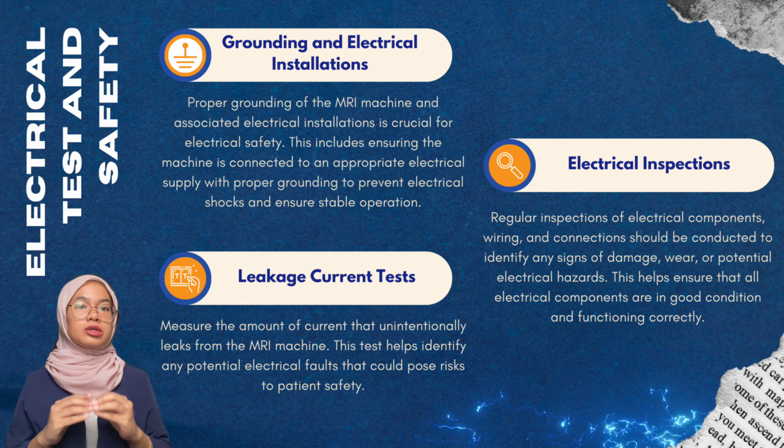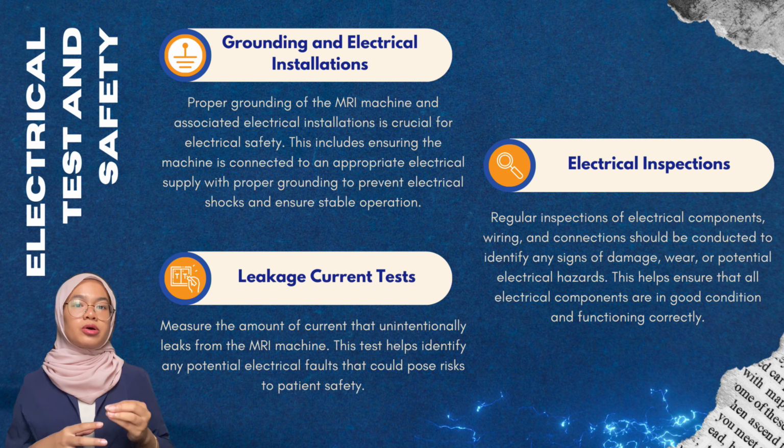Secondly, regular inspections of electrical components, wiring, and connections should be conducted to identify any signs of damage or potential electrical hazard. This helps ensure that all electrical components are in good condition and functioning correctly.